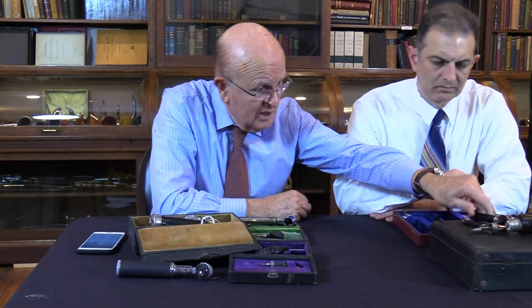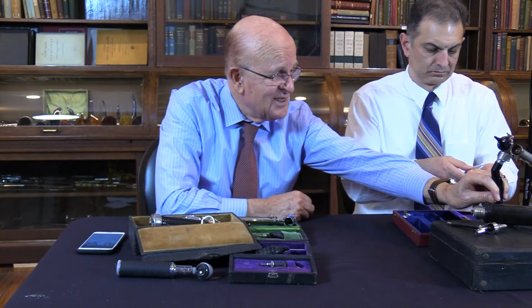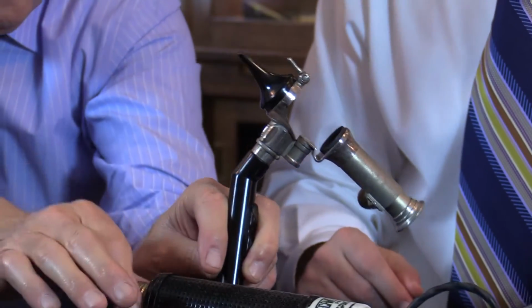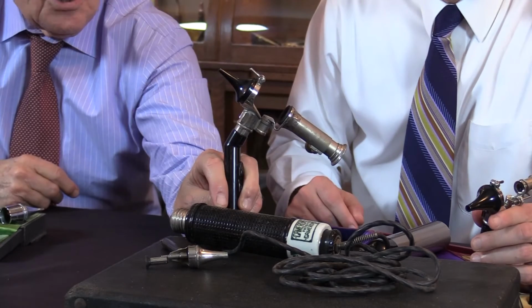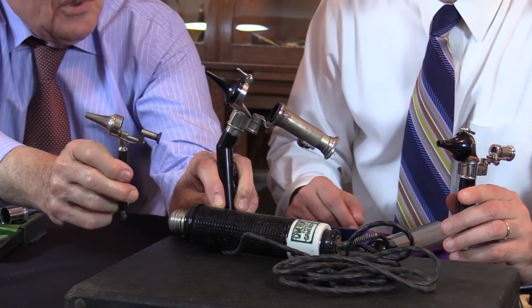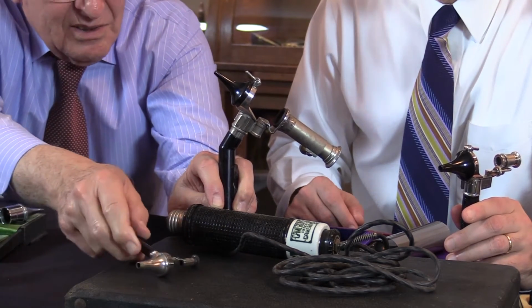In fact, they went even further. This here is a real system for magnification, and this is what you plug into the electricity and use to examine the ear. So these three here, to me, are the predecessor of what we use today, the operating microscope. So they tried at that time.